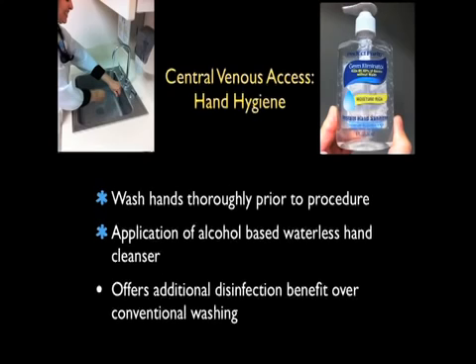nursing staff. Going through the IHI guidelines for decreasing the complication rate for central venous access, the first step is to wash your hands thoroughly prior to the procedure. As an alternative, one can consider application of alcohol-based waterless hand cleansers, which offer additional disinfection benefit over conventional washing.